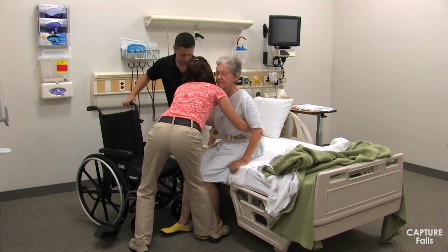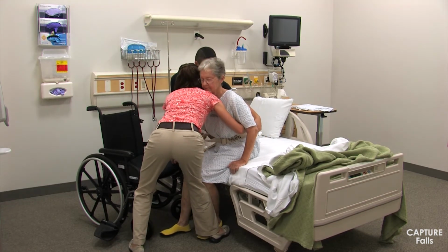The caregiver leading the transfer should be positioned directly in front of the patient with both hands on the gait belt using an underhand grip. She should be positioned very close to the patient to minimize the strain on her back and in a squat position while maintaining the natural curves of her back.